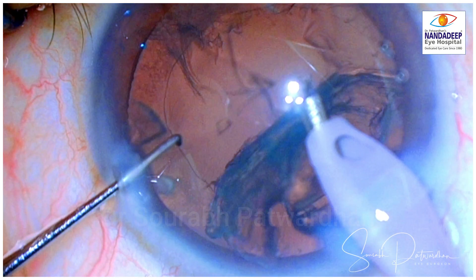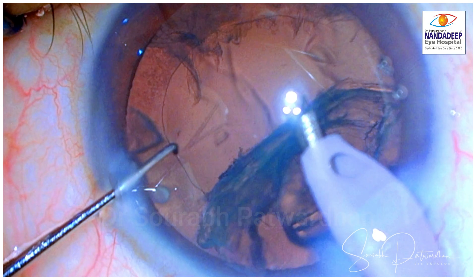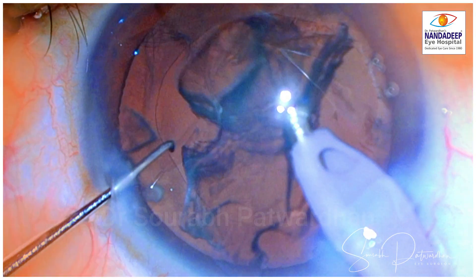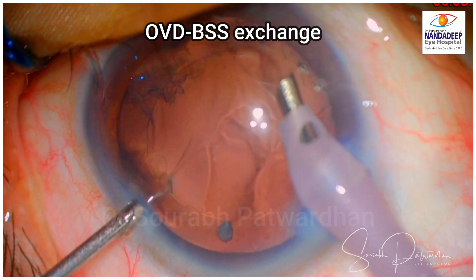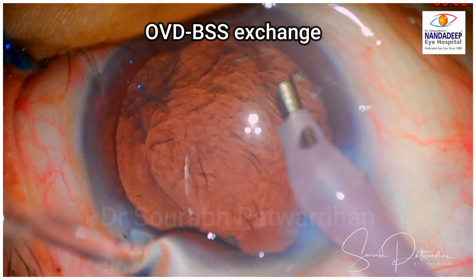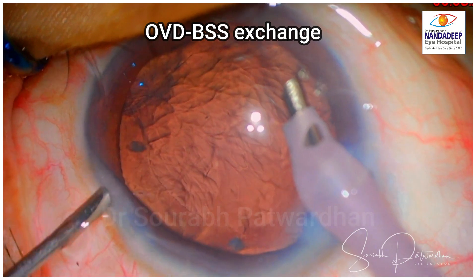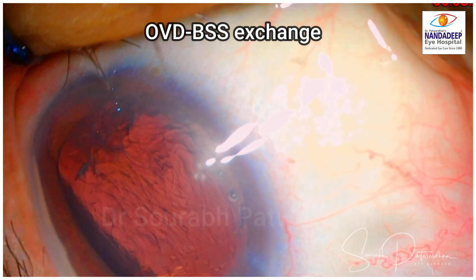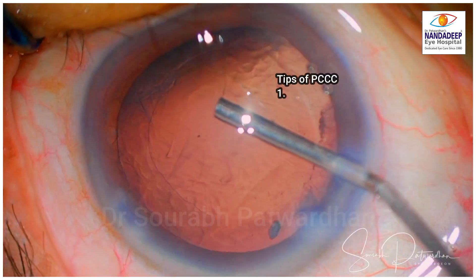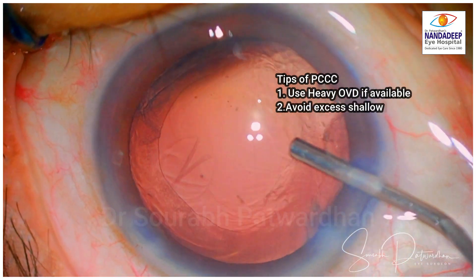Now, once I notice this, what I am going to do is perform an OVD-BSS exchange. That means I will be pushing the OVD without removing the FECO probe, making sure that the anterior chamber is relatively maintained even when I take out the irrigation. That avoids prolapse of the anterior hyaloid and rupture of the anterior hyaloid.